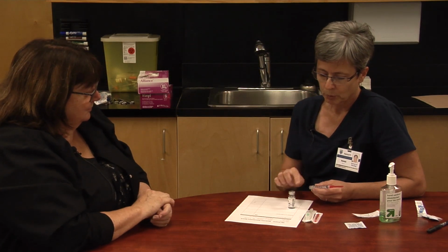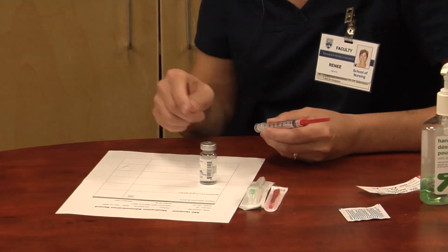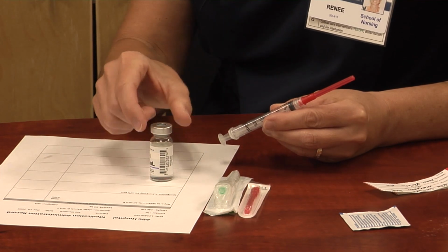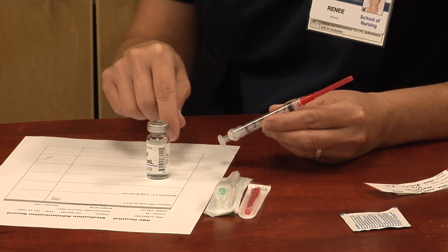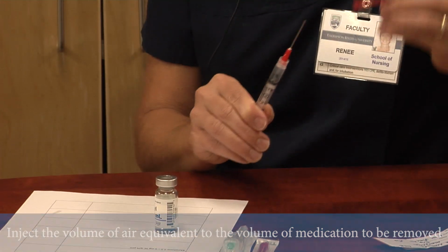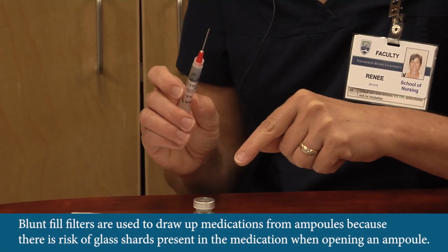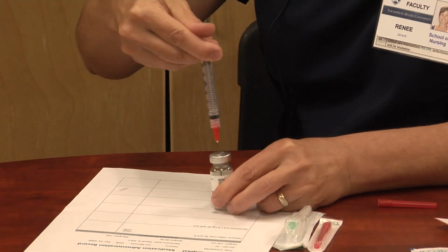Exactly. So we've cleaned our vial. We've, of course, done all of our checks. This is the correct drug for the correct patient, and I know my dose. The thing with a vial is there's a vacuum in there, so you have to inject the same volume of air in before you take your volume of liquid out. In this case, I need 1 milliliter, so I have 1 milliliter of air. I'm not using a filter this time because there's no glass. So you put 1 ml of air in there?